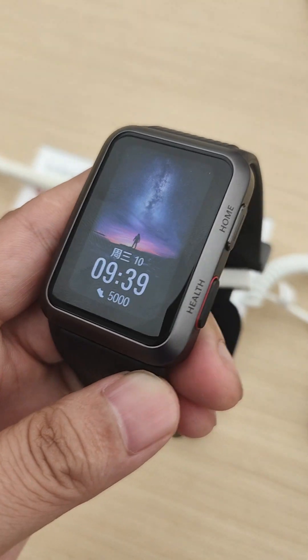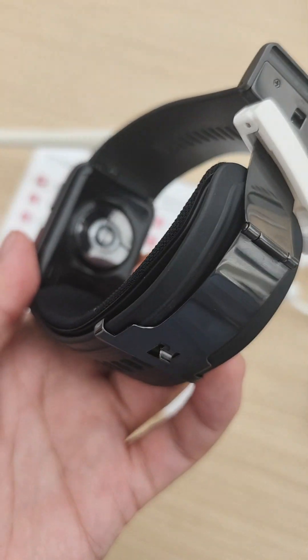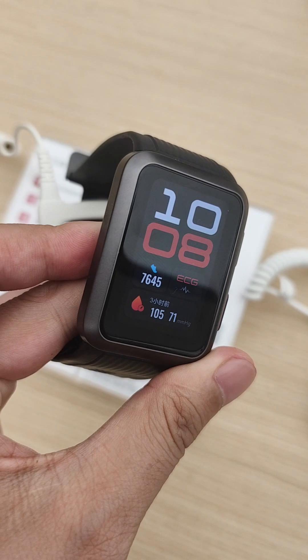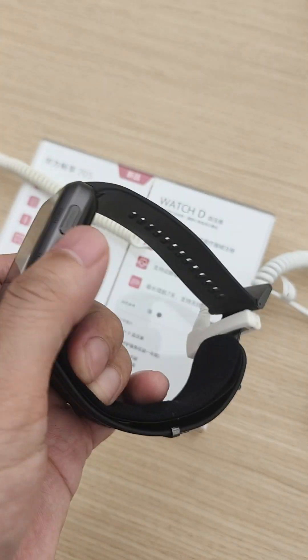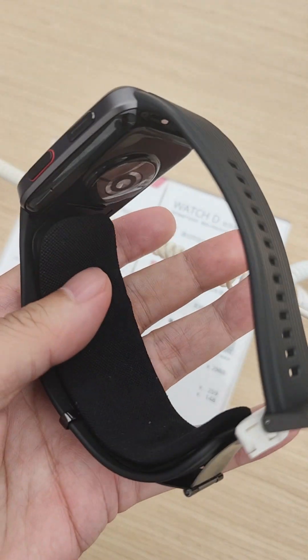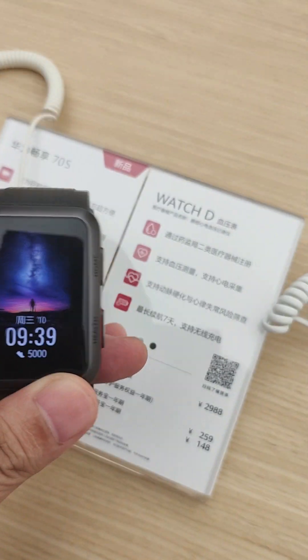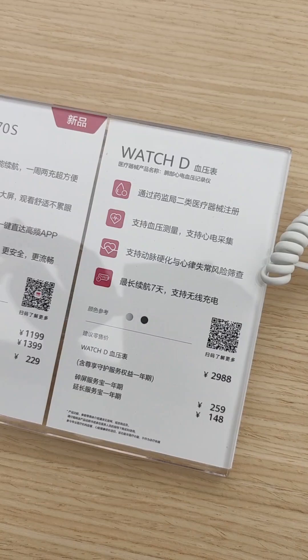Hey guys, today we go to the Huawei offline store and check out the Huawei Watch D Health Watch. It is a unique product from Huawei. We can see it has a gas bag attached to the watchband and also a close button.